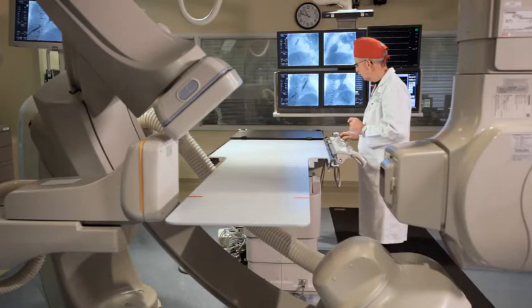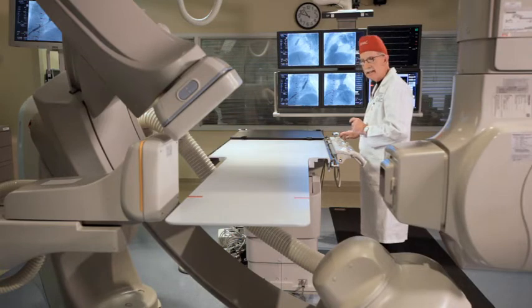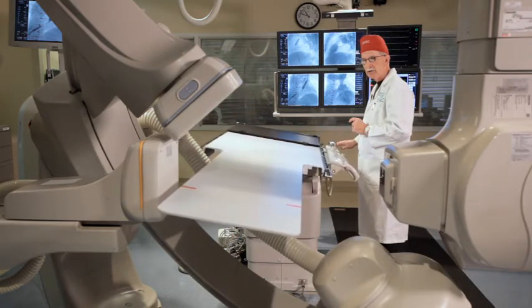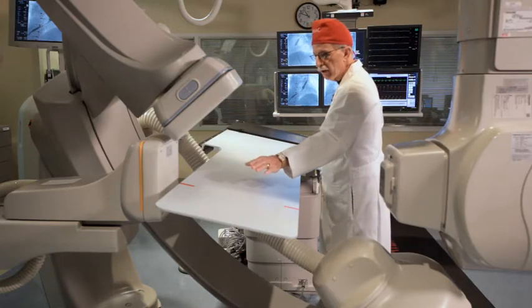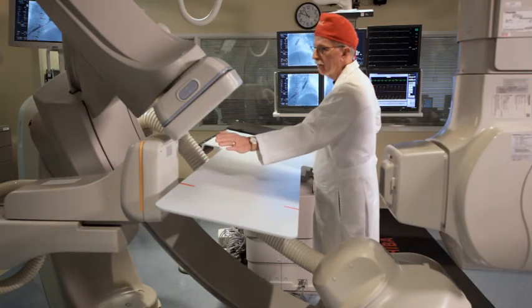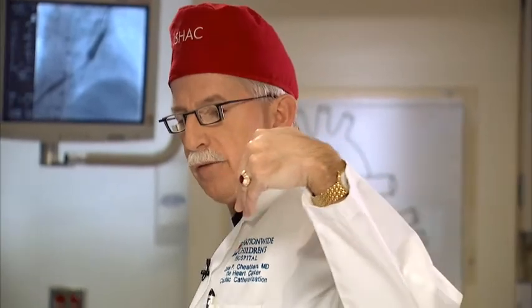What we found with the cradle features is that I can get my further left angle by cradling the patient. So what we're doing basically is moving the patient — the patient's right side is going down and their left is coming up — and that allows the camera, which is sitting here, to move further toward the left with my left up. It gives more angle, and we didn't have to move the camera at all.